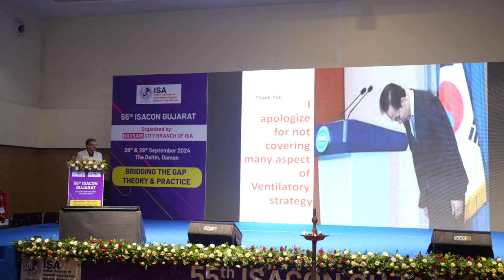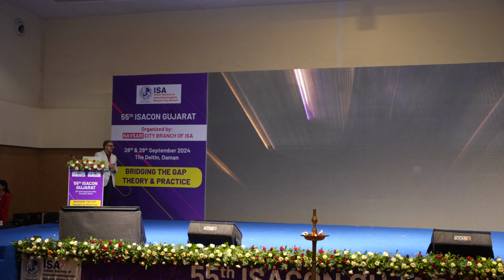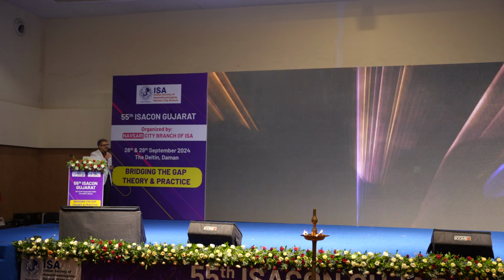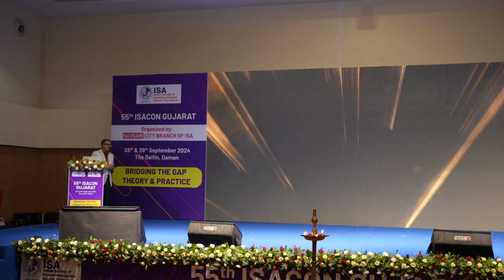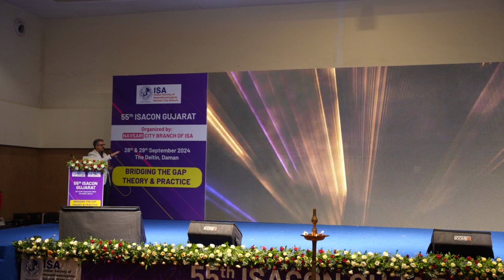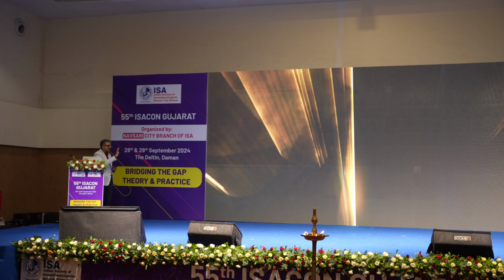Sir, I have one question in this part. Can we apply it just after extubation in the OT? Because preoperatively we do it. Yeah, so what you can do, after extubating a patient, you can apply CPAP of 8 to 10 if your machine has a CPAP mode.